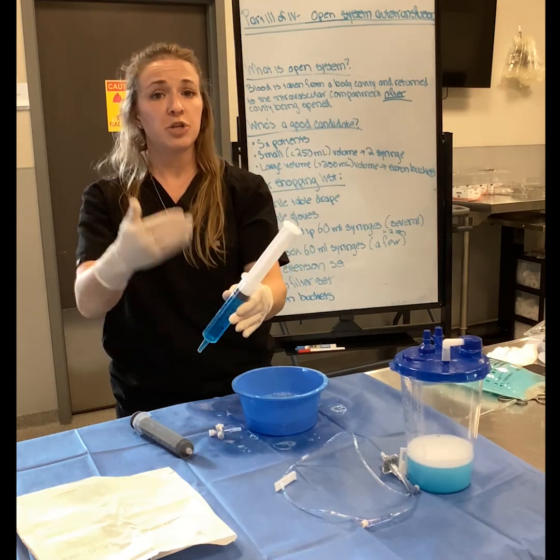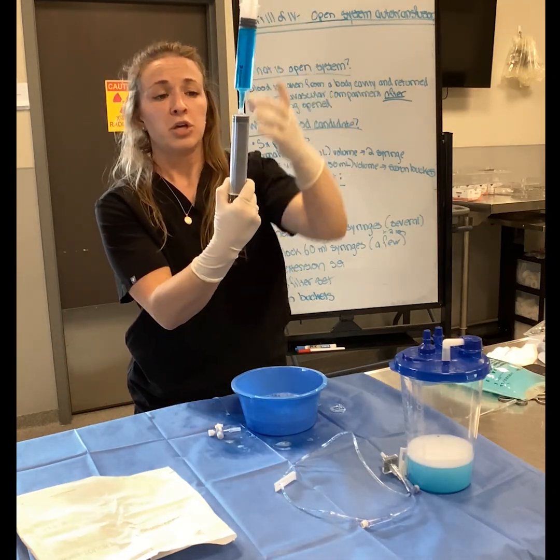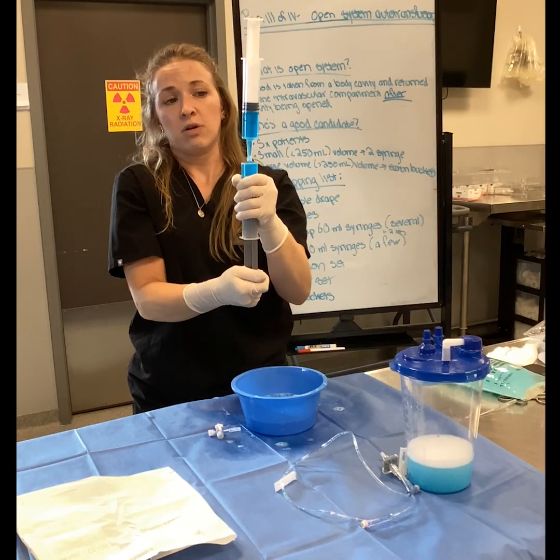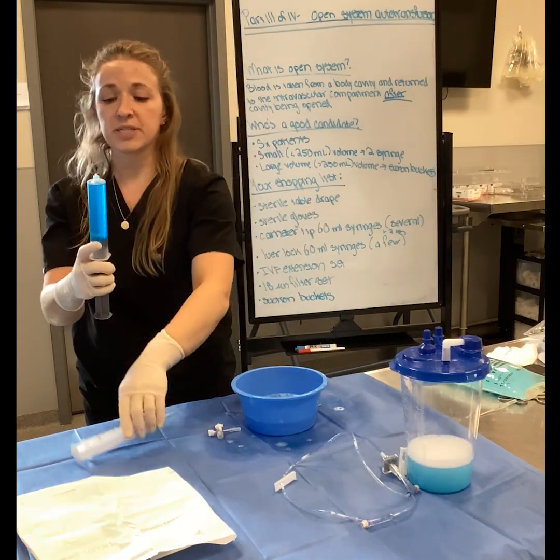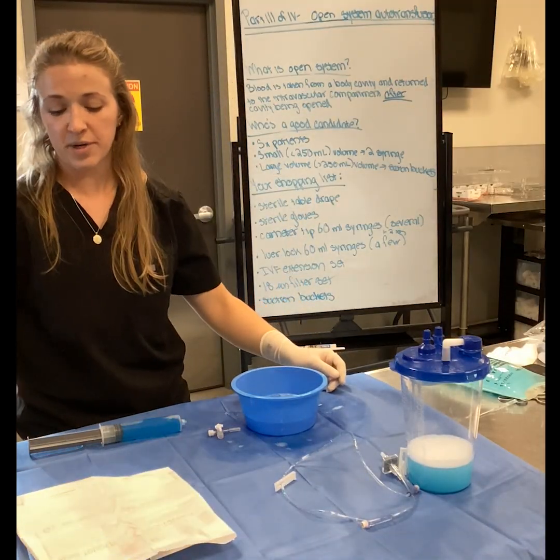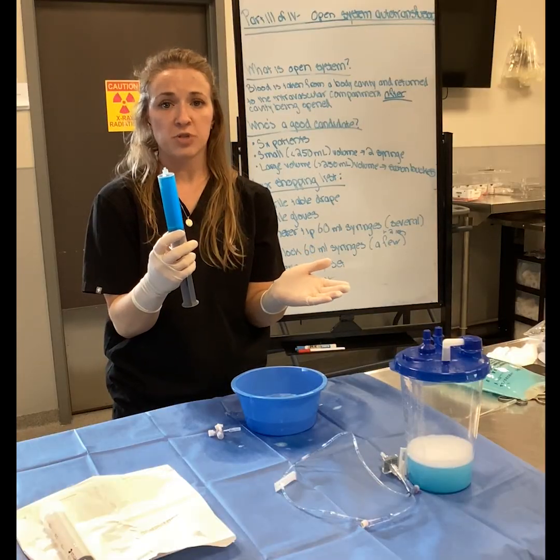They can hand it to you and you can take it, or they can hold it upside down. You just get your Luer Lock 60 underneath it. You do not need to apply pressure. And then without pushing down on the catheter tip 60, you can suck that blood out of the syringe. And at this point, the surgeon can kind of toss this one. We'll pretend that's gone away. And you have this at your disposal.